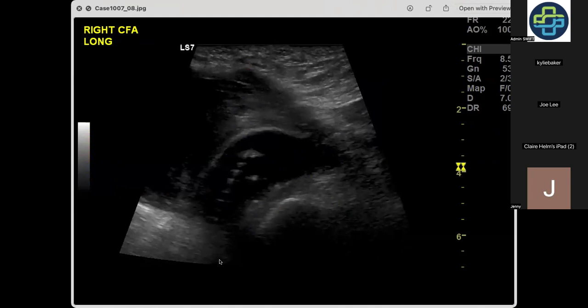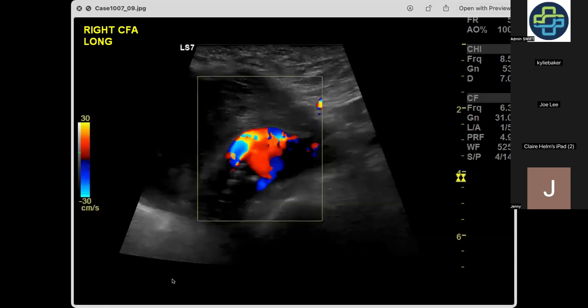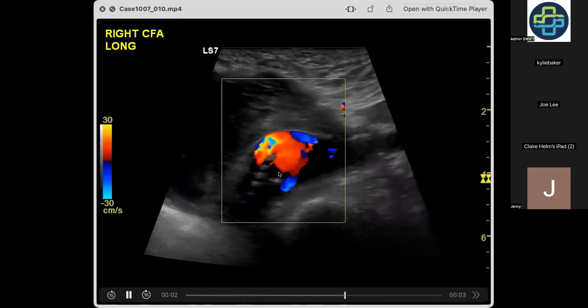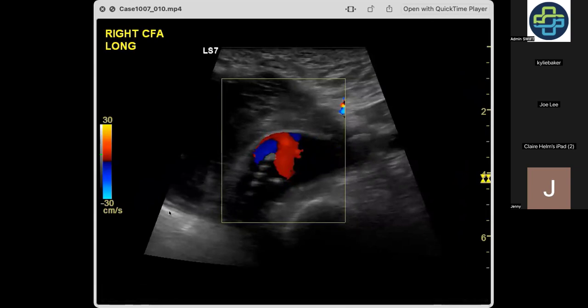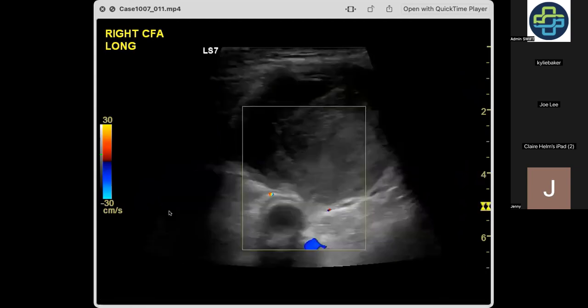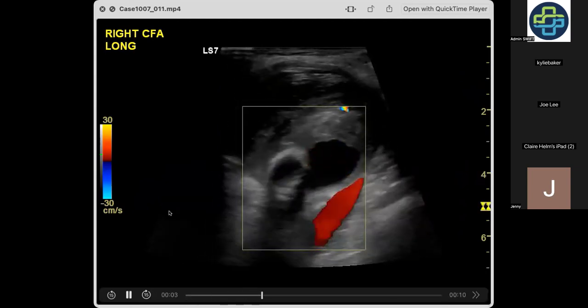You can actually see the stent and the stent's ending here. And all this stuff is definitely not a normal thing. You see the stent and the vessel's tightly adherent because this is the distal end of the stent. So that should be adherent to the wall. And this is showing that there's leakage out of it. That might be a type 1. Is type 1 the distal? I can't remember. But that's leakage at the distal attachment of the stent, whatever type that is. And again, we can sort of see it there.